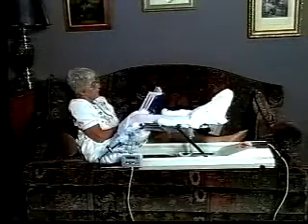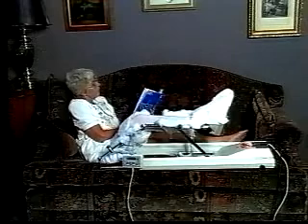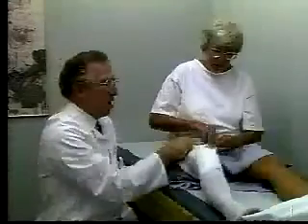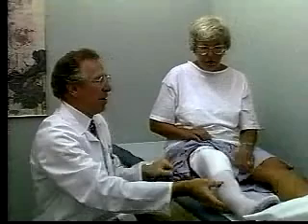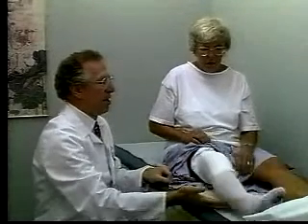The CPM machine and cold therapy unit will be delivered to your home, and a physical therapist will visit 3 times a week to continue to assist you in your exercise regime. 3 weeks after you are discharged from the hospital, you will return to our office for your first post-operative visit. X-rays will be taken, your dressing will be changed, and your overall progress will be evaluated by your doctor.